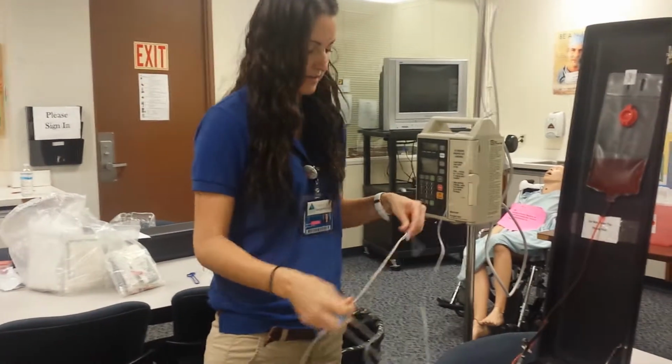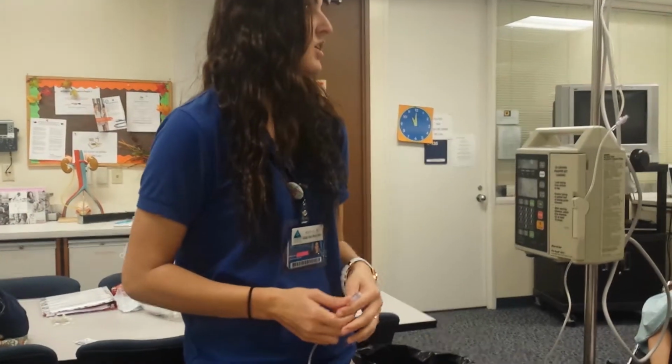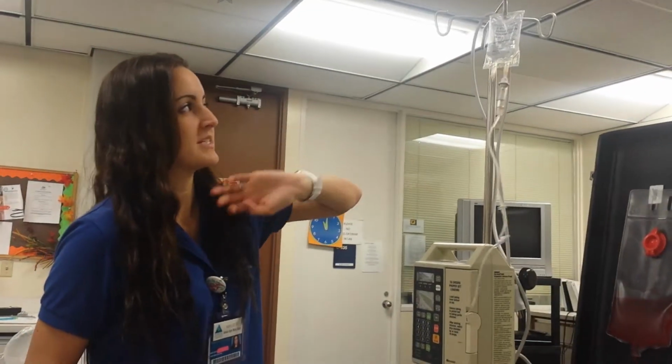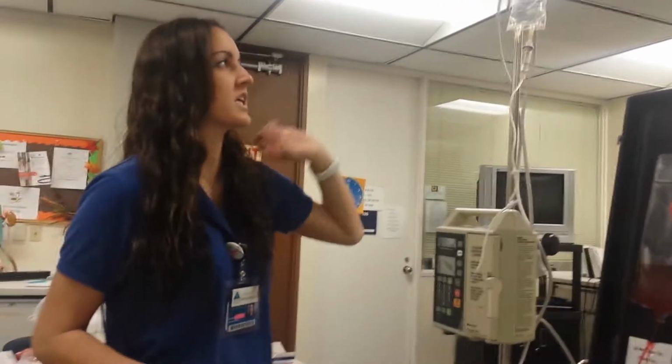Okay, and now we come in, we're going to tell the patient why we're giving the medication: because we believe you have an infection, and this is going to help. There's an antibiotic in here. I'm going to attach the label with my medication, my initials, and the concentration on the bag.